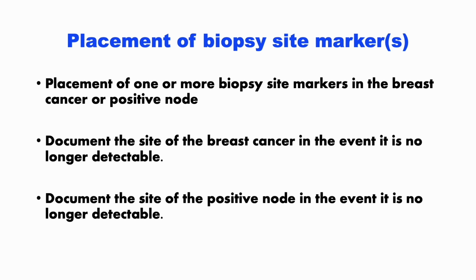And given the high rate of pathological complete response, particularly for HER2-positive breast cancers, there is a high chance that there will be no visible cancer left when anti-HER2 therapy is completed. Therefore, it's imperative that markers are placed before the therapy is initiated.